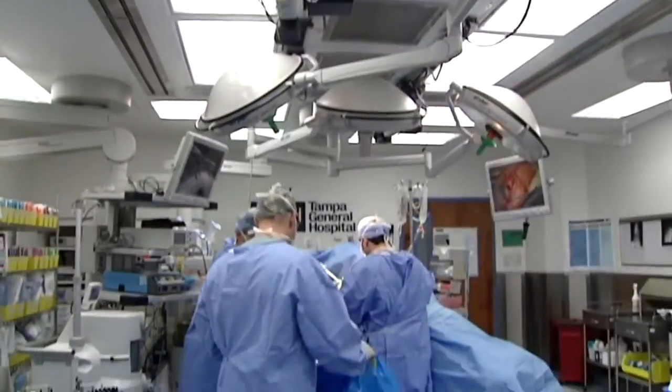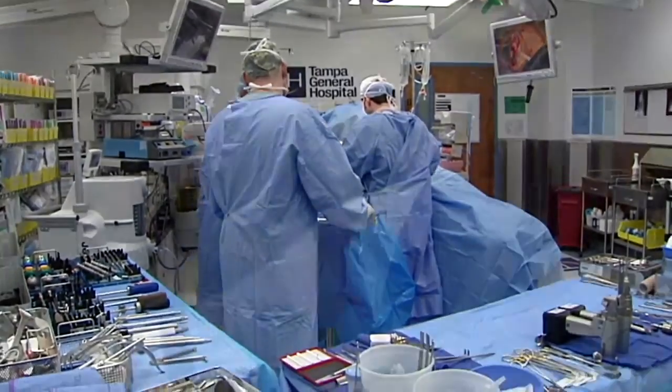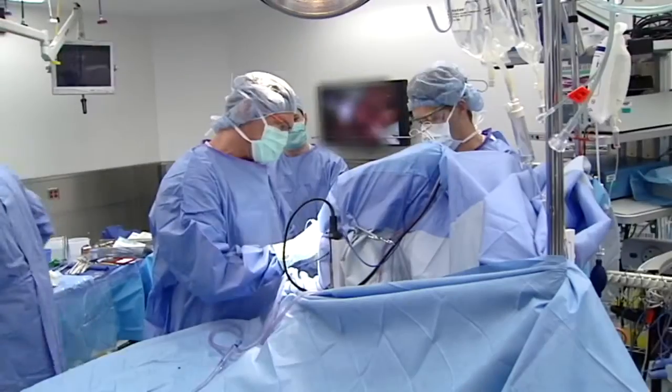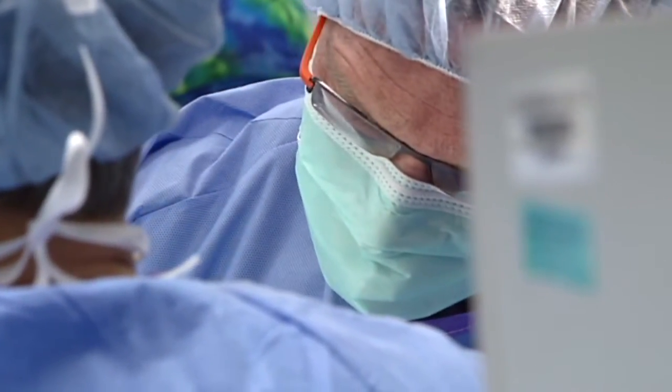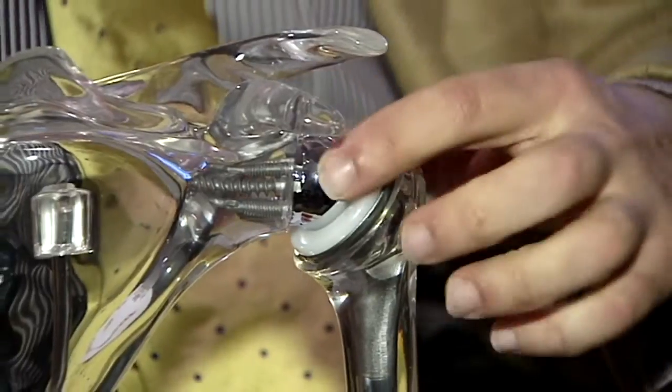This is the reverse shoulder replacement that I developed. Reverse shoulder replacement is a relatively new procedure that has been in the United States since 1998, which is when I performed the first one here in Tampa. There's a socket here and a ball here.